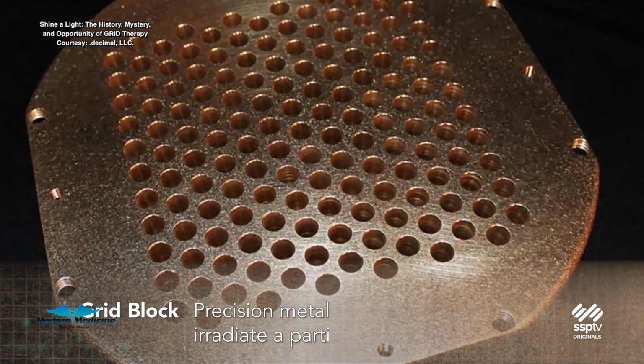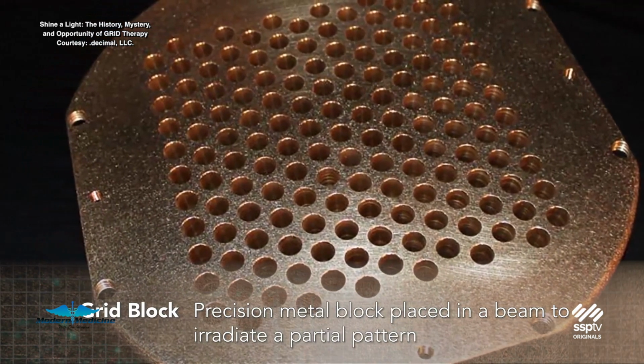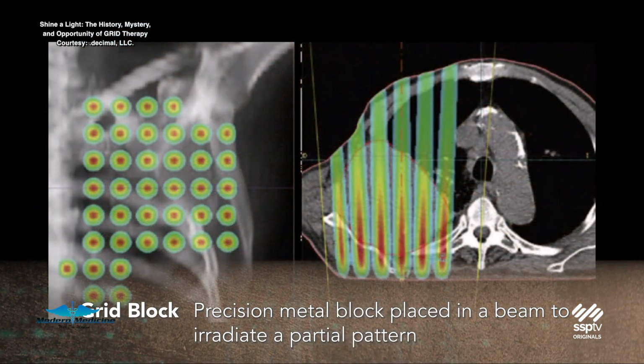He said, what if I could take this technology of intraoperative radiation and use it with photons, kind of marry it with a linear accelerator instead of the orthovoltage machine, and then see if there's a bigger response like I had seen with this grid thing before. And so he tried it. And so that's where that was born, in the 80s, where he started using the grid with the linear accelerator, getting greater depth dose penetration.